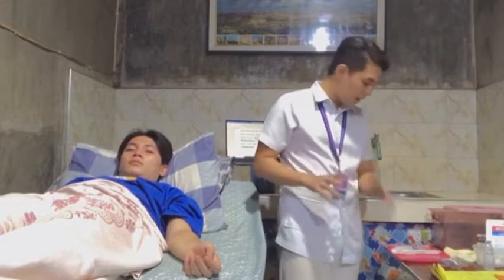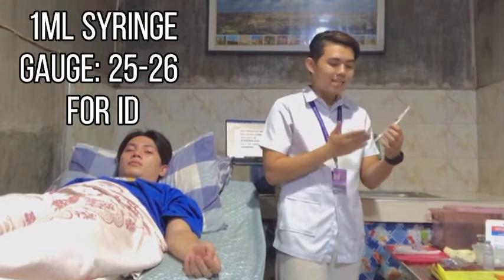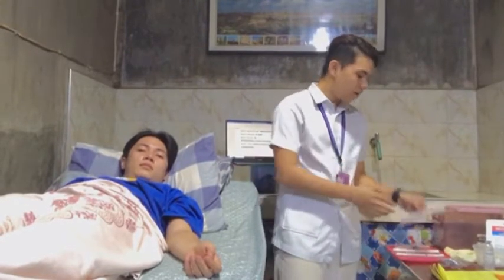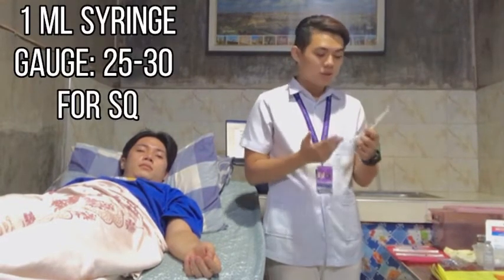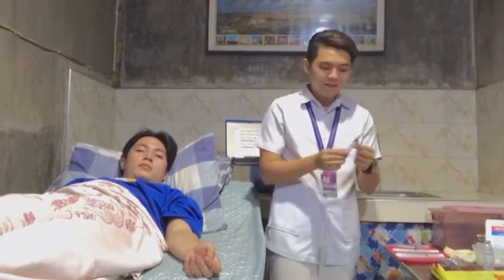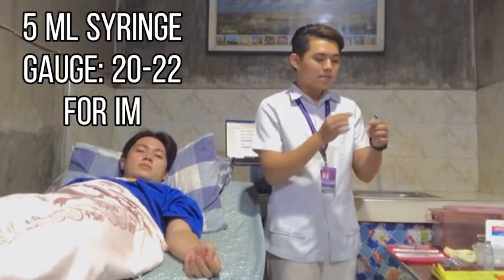So, next is that for the intradermal, of course, we will be needing a 1 ml syringe and a needle gauge of 25 to 26. And of course, we will be having another 1 ml syringe with a needle gauge of 25 to 30 for subcutaneous injection. And lastly, we will be having a 5 ml syringe for intramuscular, and of course its needle gauge is from 20 to 22.